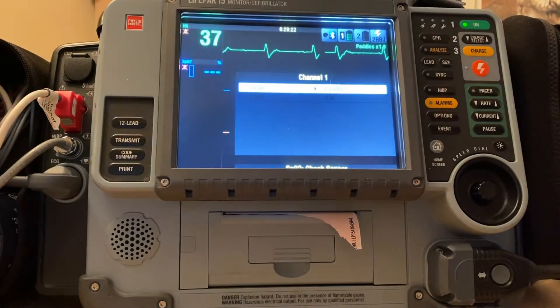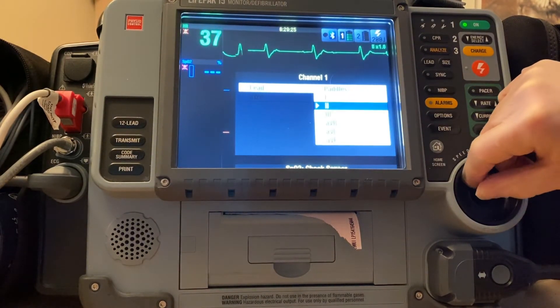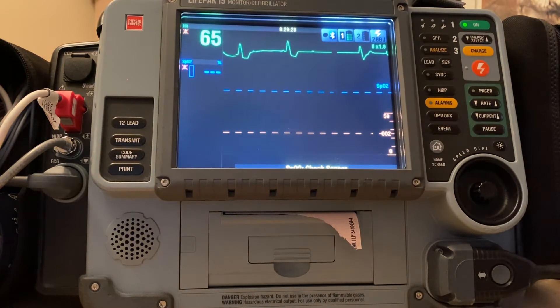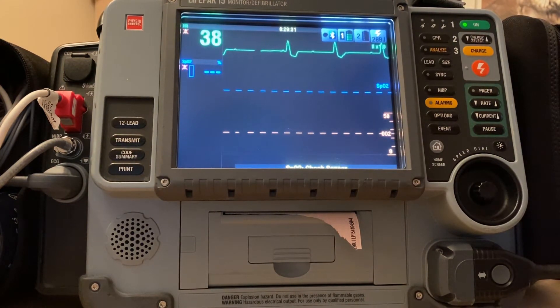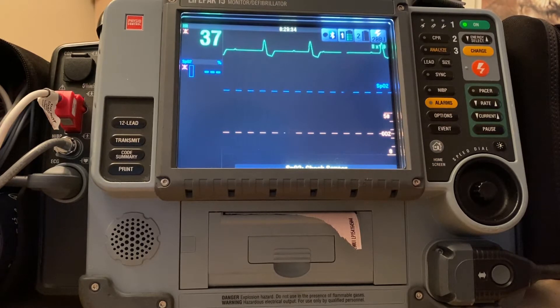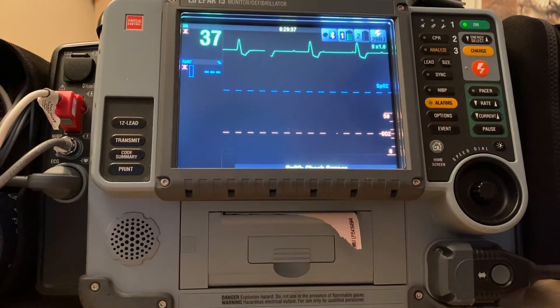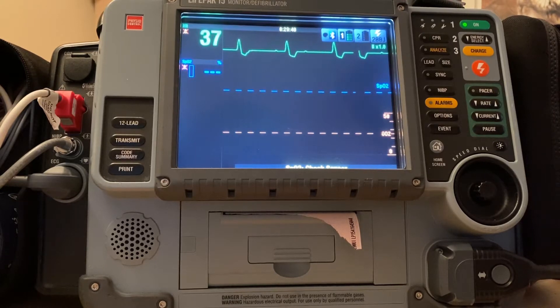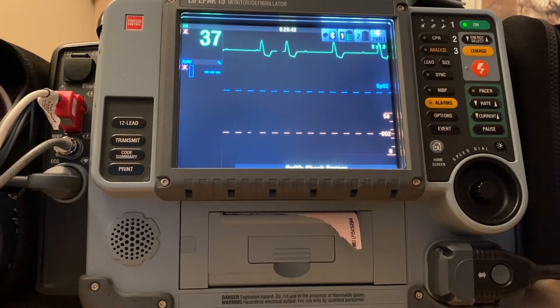We have our patient here. I'm going to switch to lead two for this gentleman. What we have here is a patient who is awake, alert, and oriented, complaining of a great deal of chest pain. We've come to check on him and find he is, in fact, quite hypotensive with a really, really slow heart rate.